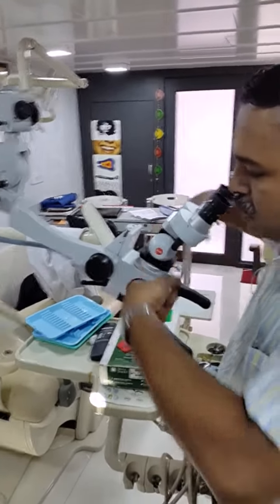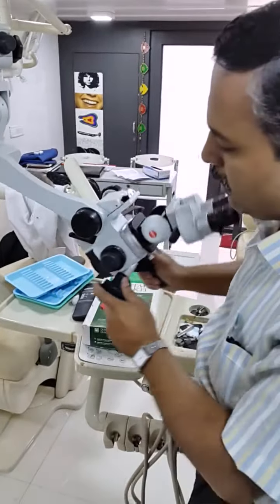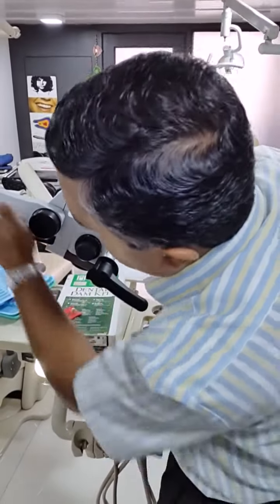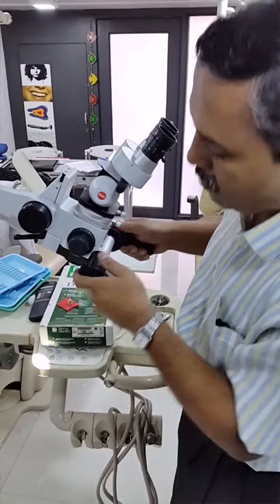The head has got a swing movement. You can press this knob and then adjust the swing movement. Normally this has to be parallel, so you pull this knob towards the outside to get it locked.